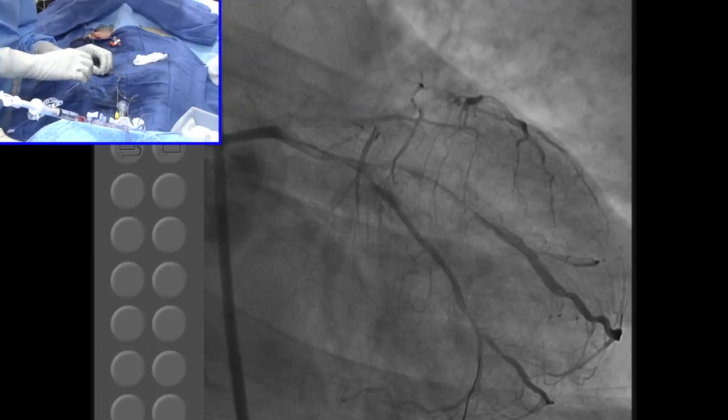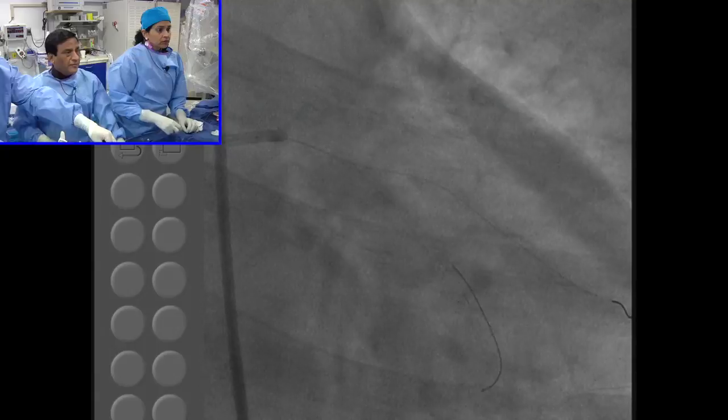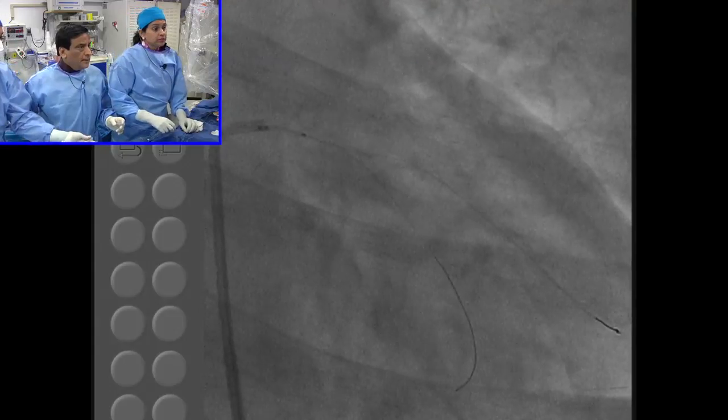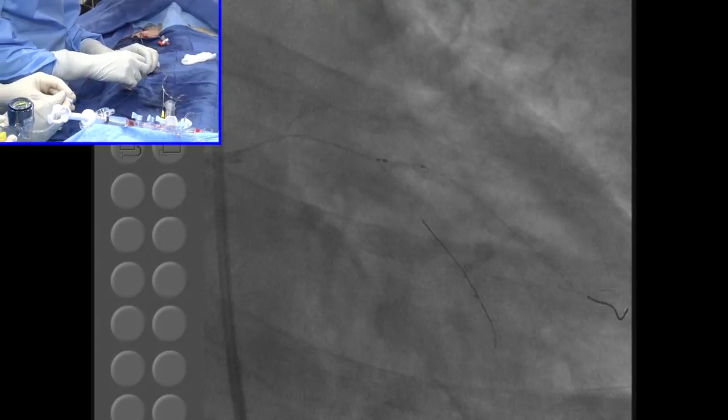I mean, clearly that having a stent thrombosis, which we knew when we were part of the trial, that after 1-2 years, patients started coming back with a stent thrombosis. We have to talk about our handbook, the technique. It will be coming out, we'll show it now. Yeah, but then we'll show it by itself.